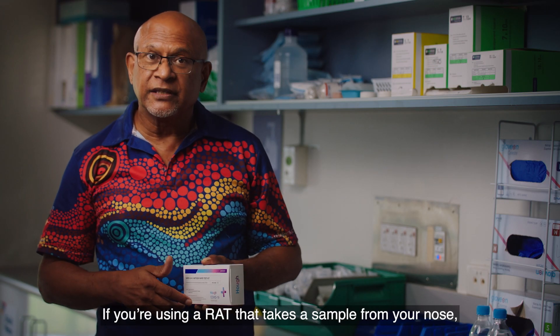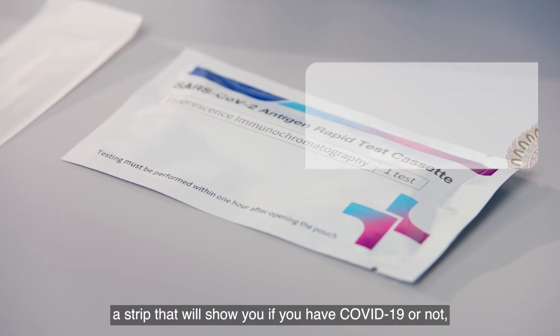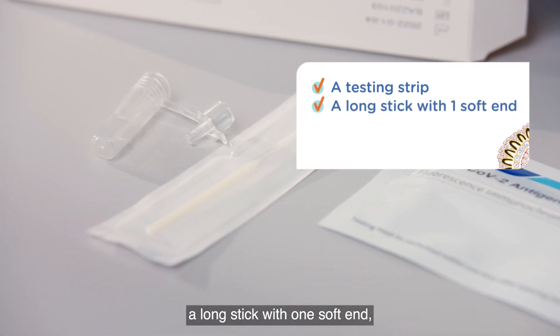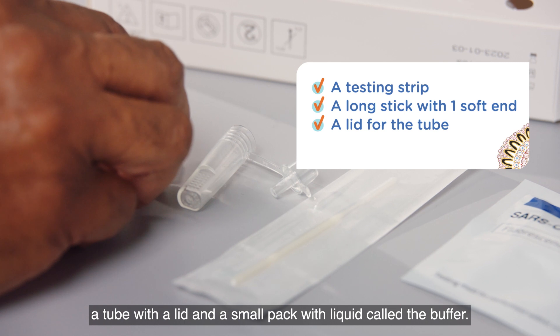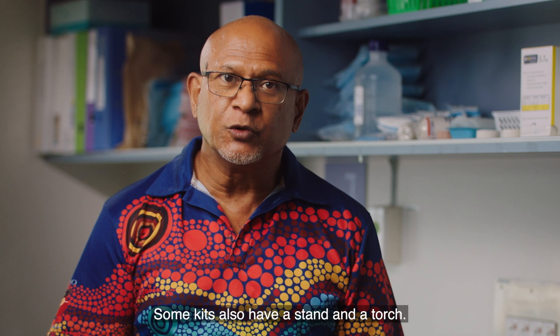If you're using a RAT that takes a sample from your nose, inside your toolkit you'll find a strip that will show you if you have COVID-19 or not, a long stick with one soft end, a tube with a lid, and a small pack with liquid called the buffer. Some kits also have a stand and a torch.